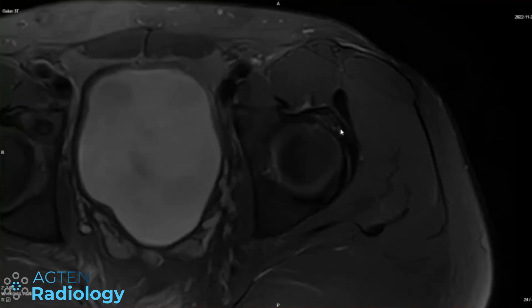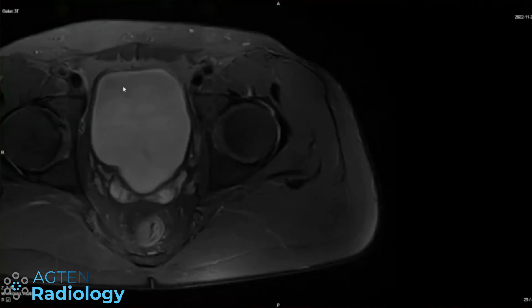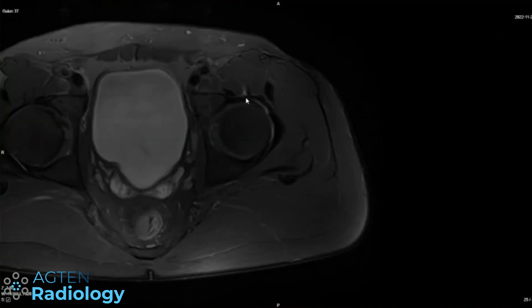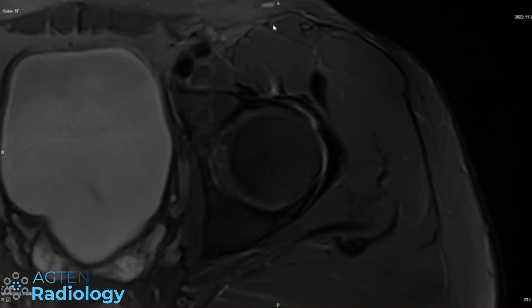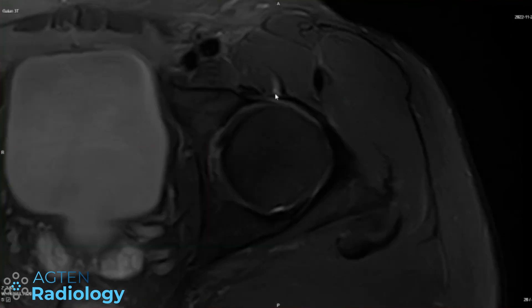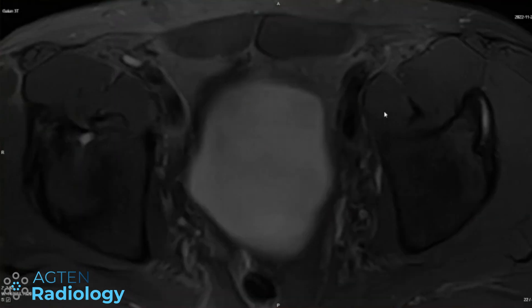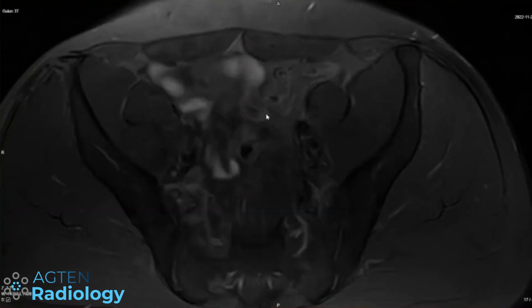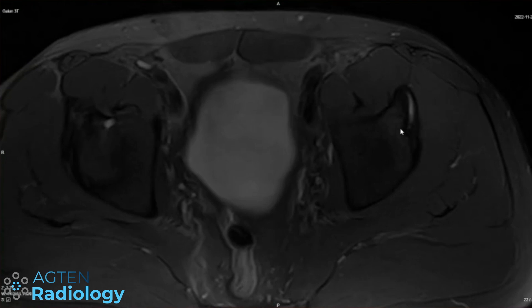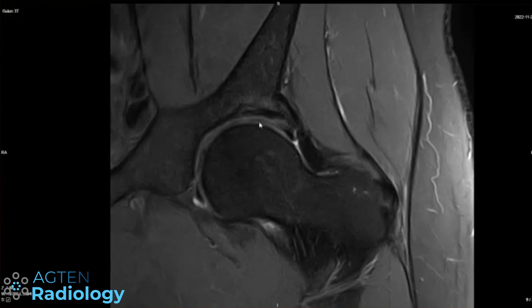This is just a vessel up here — this is too high. Down here there's a bit of edema, but this is distant from what you're questioning. Something like this is more in the area of the bursa — the iliopsoas bursa — there might be some irritation here, which could also be an explanation for any anterior hip pain. I would have to check both sides. I don't think I would make much out of it; I don't think it has clinical relevance.